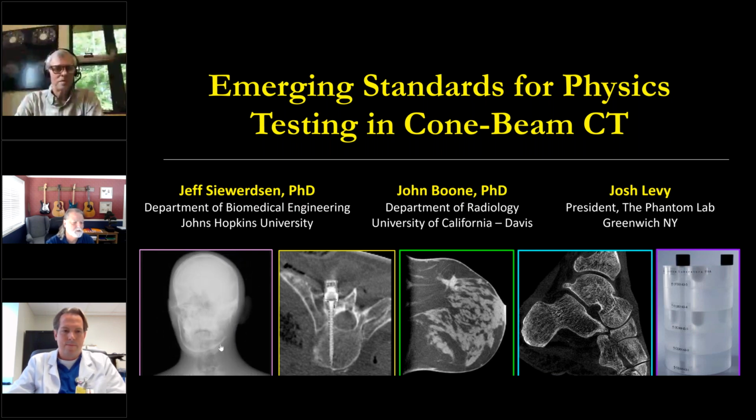Jeff was instrumental in the development of IGRT, image-guided radiation therapy, where most patients who undergo radiation therapy have a cone beam CT scan prior to their daily treatment to make sure that they're aligned properly with the treatment beam. The second slide at the bottom shows his current work on essentially image-guided surgery for head and neck and spine surgery, as you can see illustrated there.